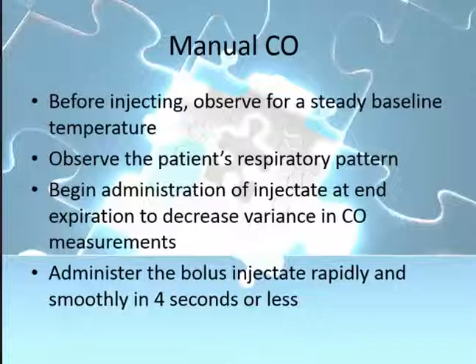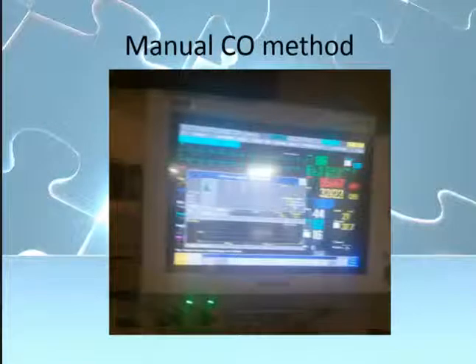So you're going to administer the bolus, which is 10 milliliters, rapidly and smoothly in 4 seconds or less. And if you have not ever injected for cardiac output before, there's a lot of pressure involved with it, so you kind of have to have a little bit of strength to inject. Again, another screenshot of what the manual cardiac output method looks like.